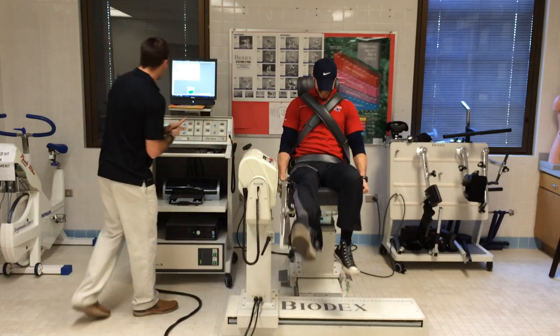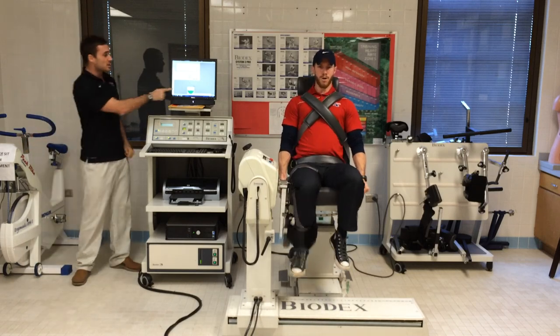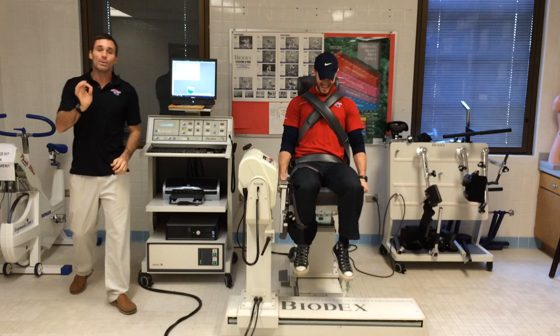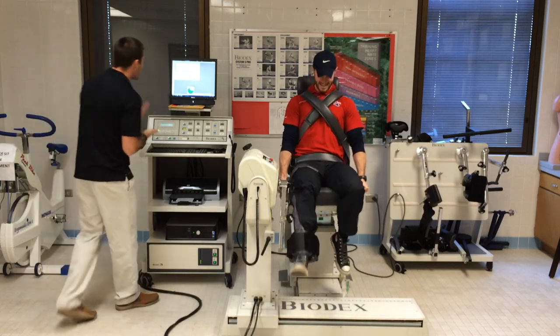Harder, faster, keep going, come on, Bo, you got this. Keep going. Remember, we as technicians can see where he's at. He cannot. We don't want him to know where he's at throughout the test. Keep pushing, Bo, keep going, you're doing great.